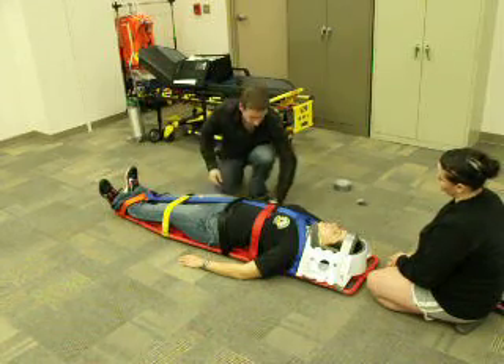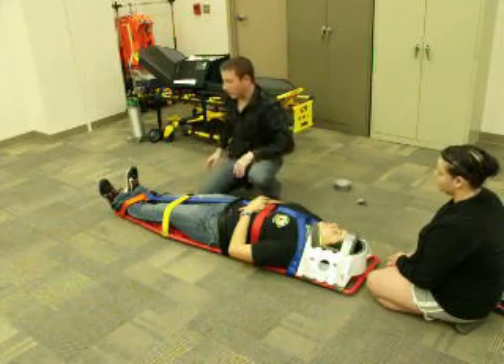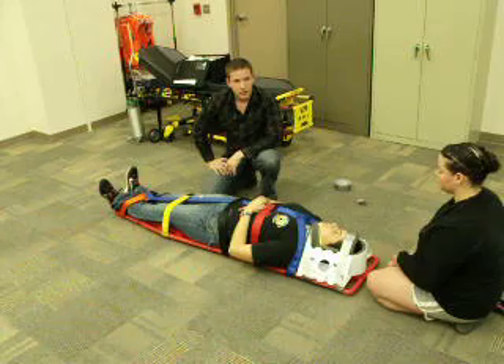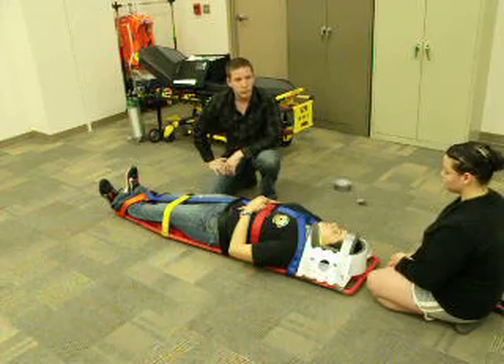At this point in time, if the patient is able, I'd ask her to interlock her fingers, and I would secure the feet with tape, then we would transport. I am now finished with this exam. Is there anything that you would like to add, change, or do differently? BSI, if I hadn't said it before — thank you very much.